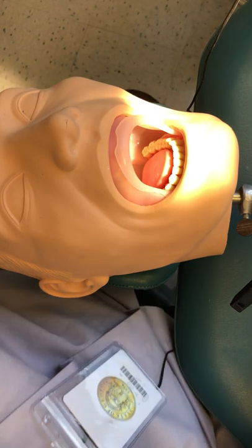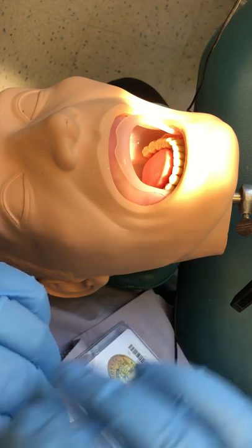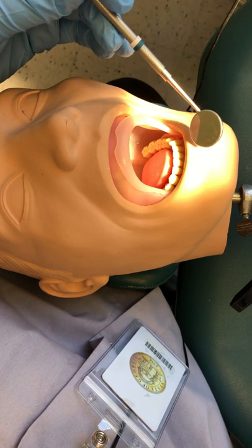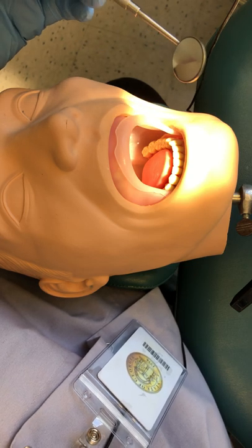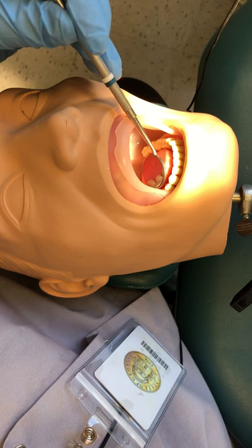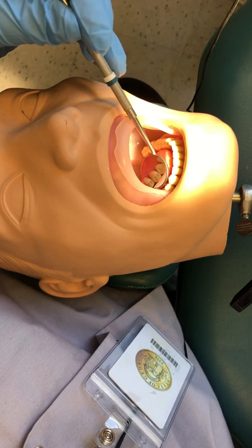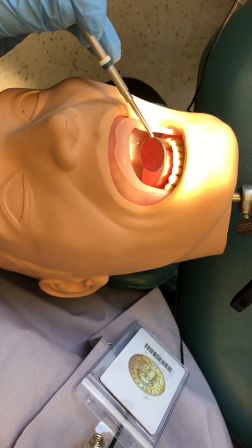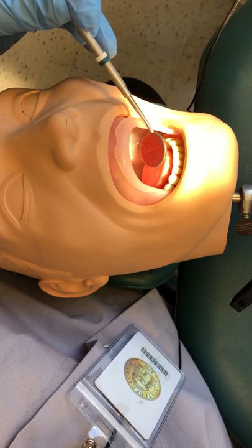For indirect vision, you're simply going to position yourself as the operator and get as close to your patient as possible. Hold your mirror in your non-dominant hand. I'm operating as a right-handed operator, so I'm going to hold the mirror in my left hand. I am looking at the linguals of the maxillary teeth. I'm sitting upright in the operator stool with my head slightly tilted downward so I can look in the mirror.